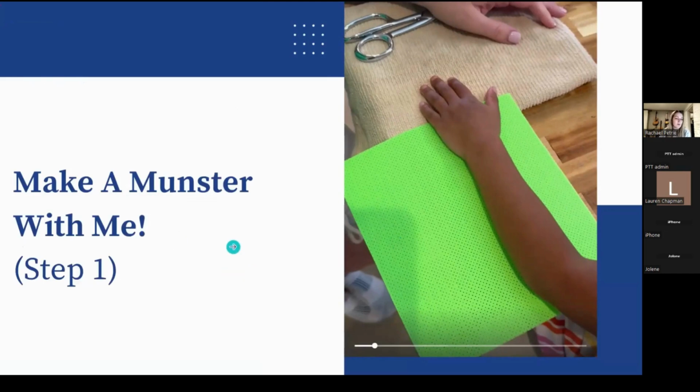Okay, so I'm going to go ahead and play this video now. You can see the little girl that we referenced earlier. I'm going to make a little Munster on her so you can see. So a Munster splint, in case you don't know, you can fabricate it in different positions. In this one, I'm going to put her forearm in neutral. A Munster is good if you have like a both bone forearm fracture after a fall. If you're in the NICU, I've made this on a brachial plexus injury before. So somebody that is really rotating into that pronated position. Lots of different uses for the Munster.